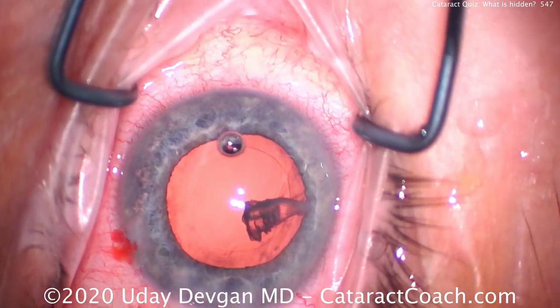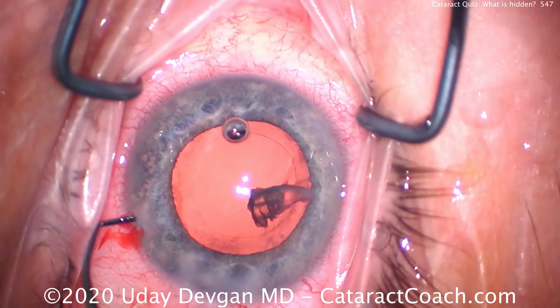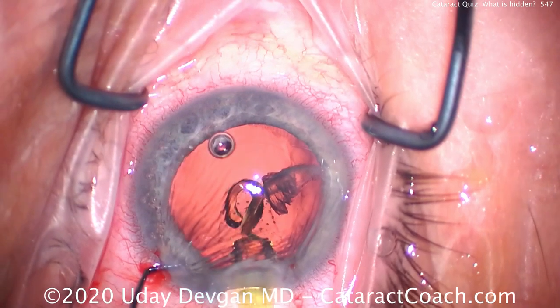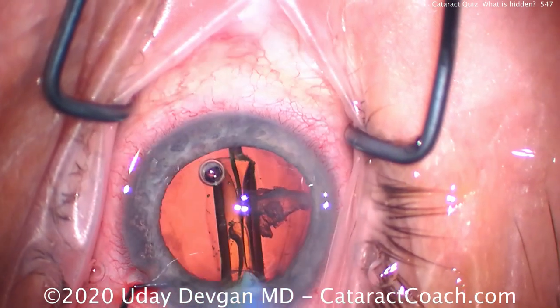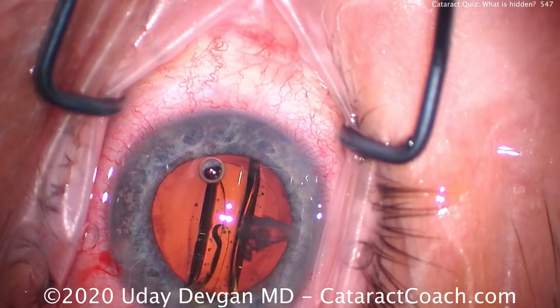Now use some viscoelastic to push that nuclear piece out of the angle and put it in front — there it is. Clearly, if you had left this in the eye it would cause so much inflammation you'd have to return to the operating room. So it's important to get this out on the day of surgery, at the time of surgery.